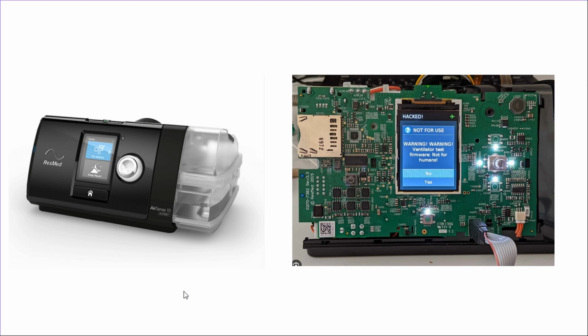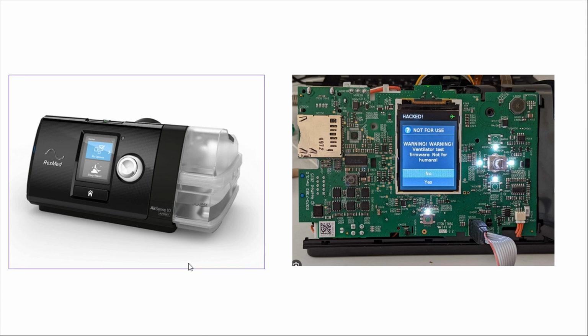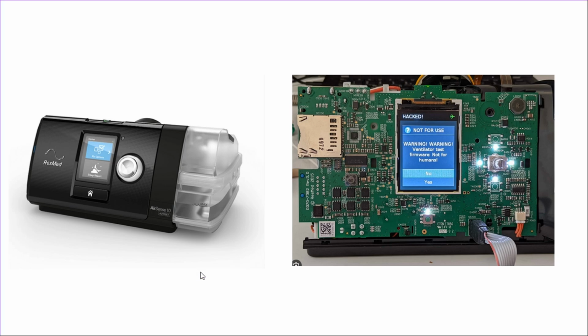Today we're going to be taking a look at the AirSense 10. This is a generation behind the current AirSense 11, but still relevant enough and still used by hundreds of thousands of patients. So it's going to be a good indicator as to what kind of electronics we're going to be utilizing in this project.